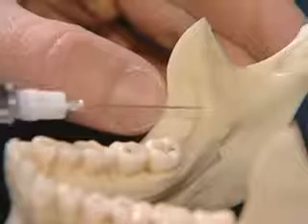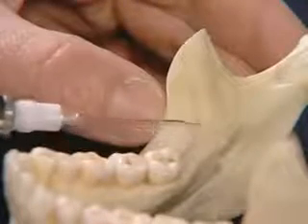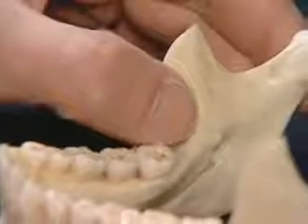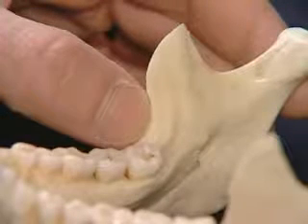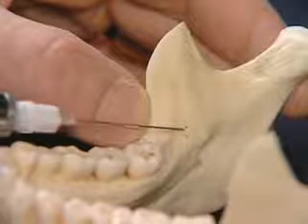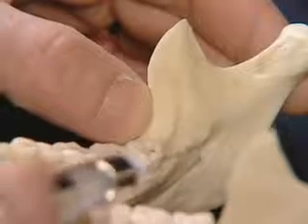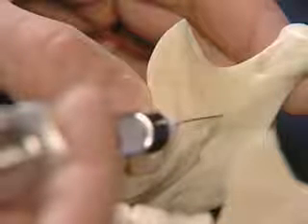The next stage is to palpate the internal oblique ridge, which is the next prominence as you move your finger or thumb in medially. That should be palpated, a mental note made at that point, and then your finger or thumb again withdrawn laterally, pulling the soft tissue landmark with you. It is just medial to the internal oblique ridge that the needle will be inserted. At this point, you're ready for needle insertion. The needle is advanced just behind the lingula until it hits the mandibular sulcus. It is at this point that the mandibular nerve inserts into its foramen.